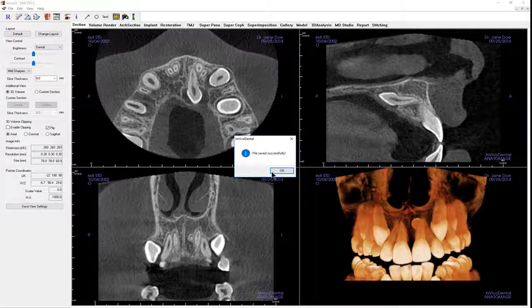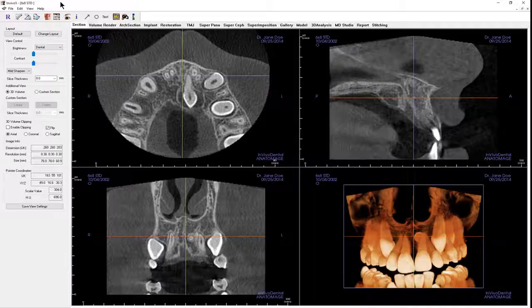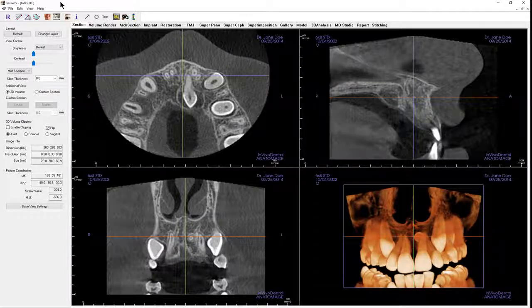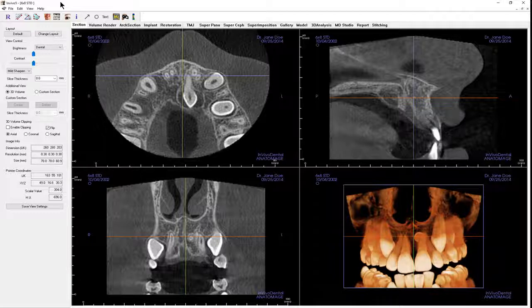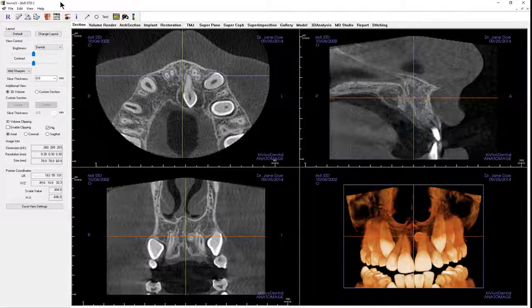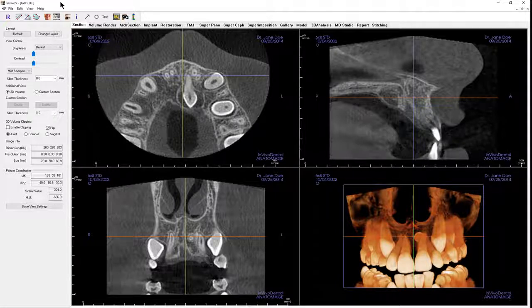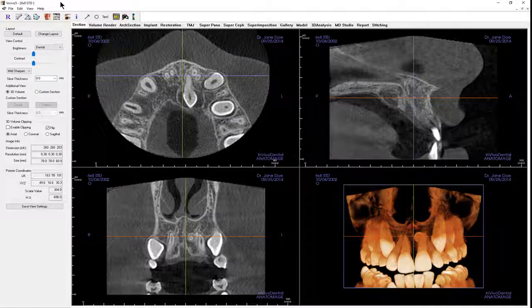The scan will be saved as one file that contains both the scan data and any workup data. An in vivo file can only be opened in in vivo, TX Studio, or related free viewers. In vivo is the recommended file type to send to a recipient if they are not expected to have any DICOM software.